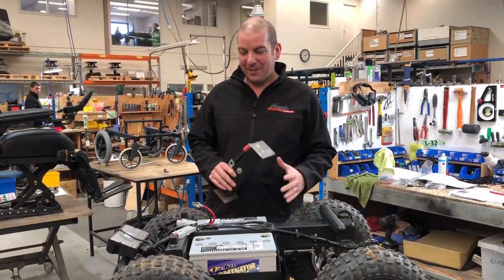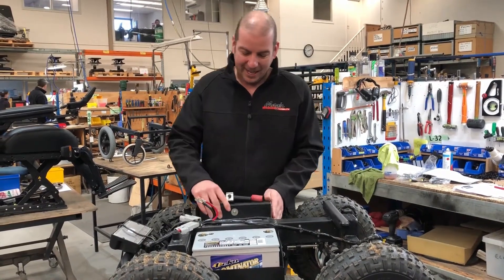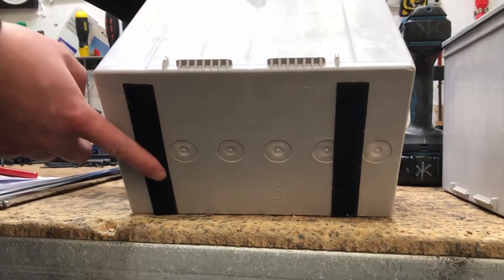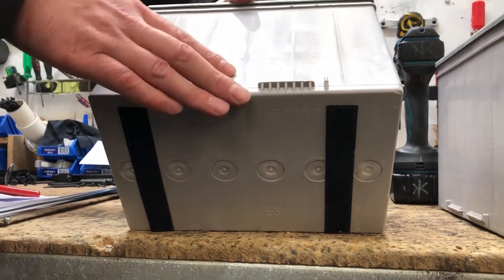Now that we've got the covers off and the terminals disconnected, we get our battery lifting tool and lift the batteries out. Before fitting the new batteries, make sure you put the velcro strip underneath to hold them in place more securely, and then they're ready to go in.